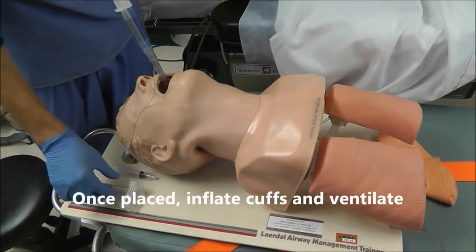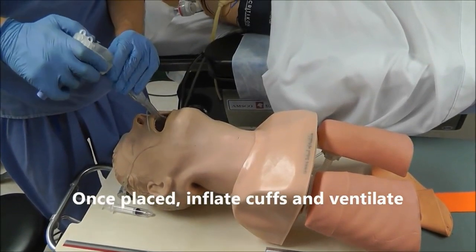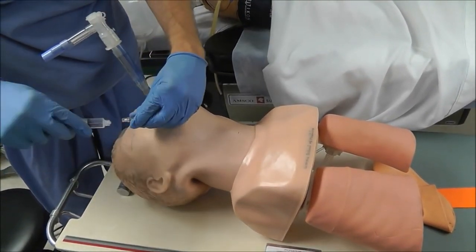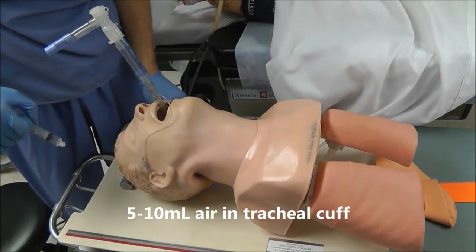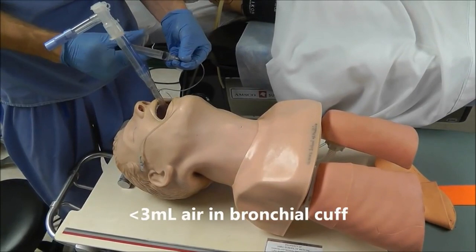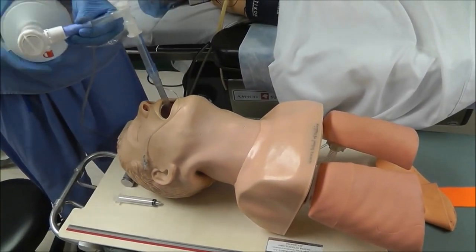Once this double lumen tube is in, we're going to need to ventilate the patient, so we need our adapter here. So we hook up our adapter, then we inflate our cuffs. We put some air in the tracheal cuff, and then some air in the bronchial cuff, and you really only want to put 2 to 3 cc's of air in this bronchial cuff. Now it's time to ventilate the patient.